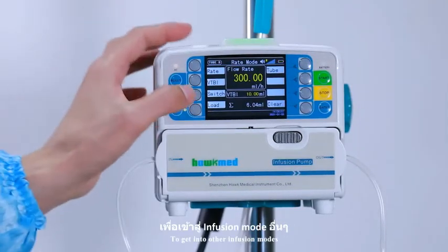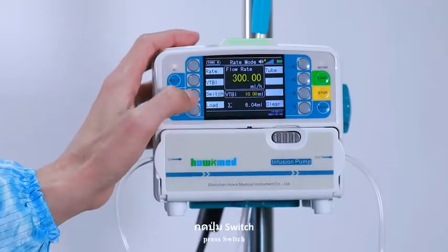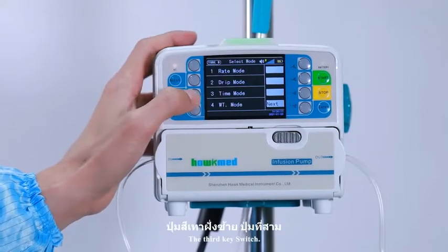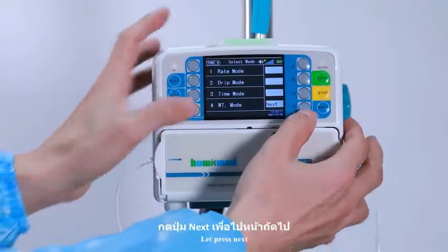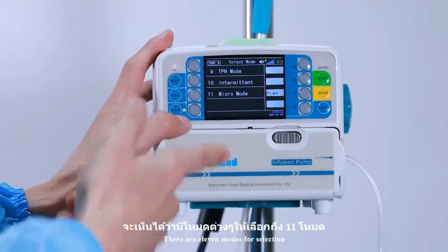After finishing, it will return to the previous flow rate. To get into other infusion modes, press switch — the third key. Press next, next. There are 11 modes for selection.